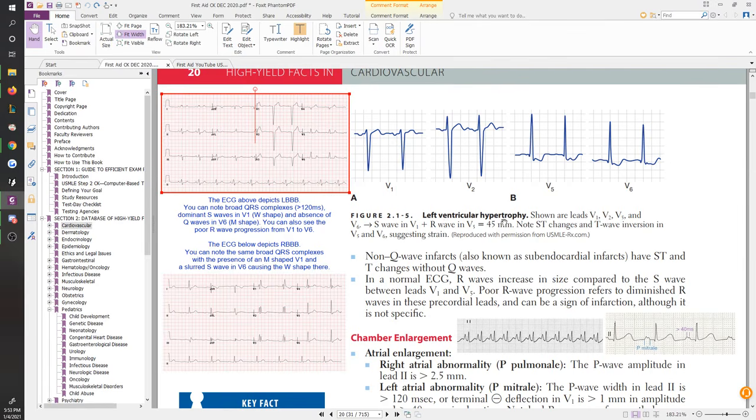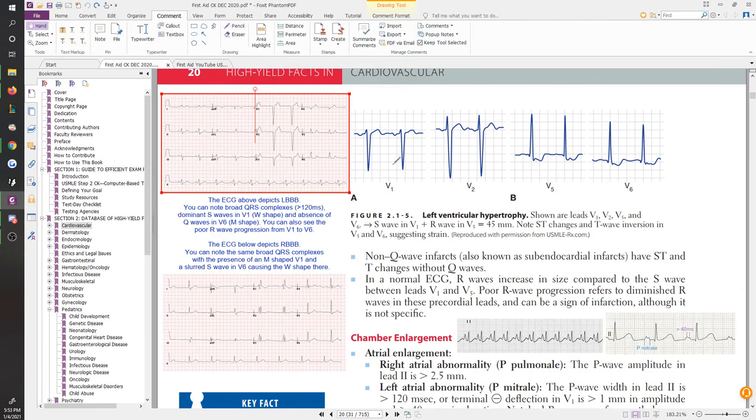So what we're seeing for left ventricular hypertrophy, they're showing you leads V1, V2, V5, and V6, which is all related to the R wave progression of your V1 through V6. So V1, we know, is supposed to be pointing down, so that's great. But it's supposed to be pointing down tiny, not so long, right? So you can already see this is a little too long. V2 is also too long. And V5 and V6 are pointing up, which is also good. So what exactly are we supposed to be catching here? Well, for ventricular hypertrophy, and this is probably not something you're expected to actually do on the test, but more so pick answer choices with.